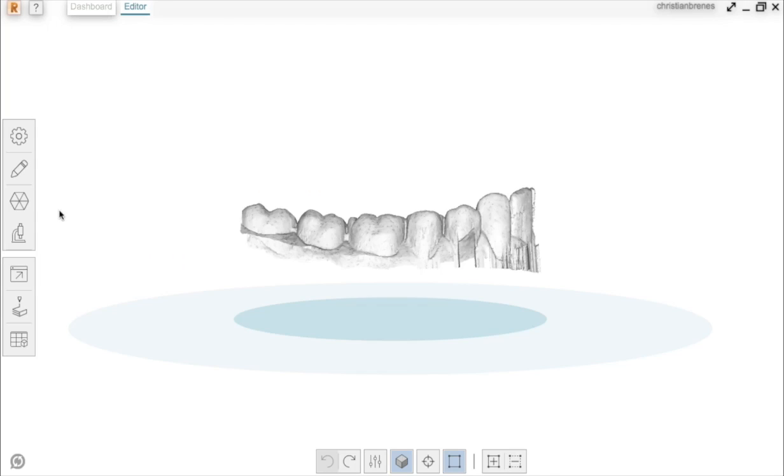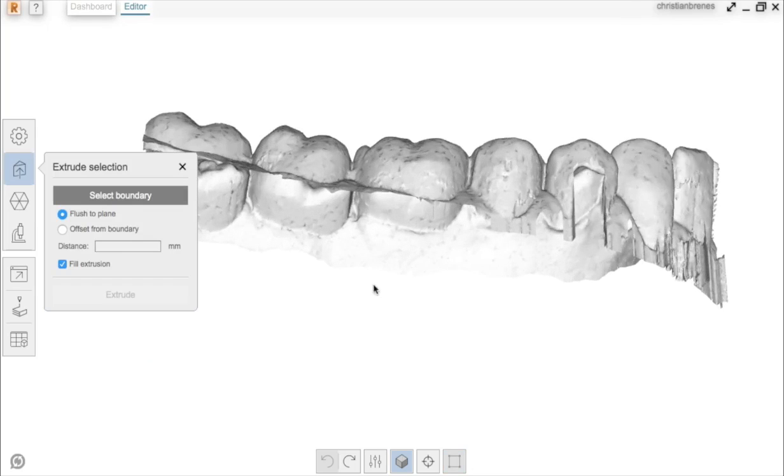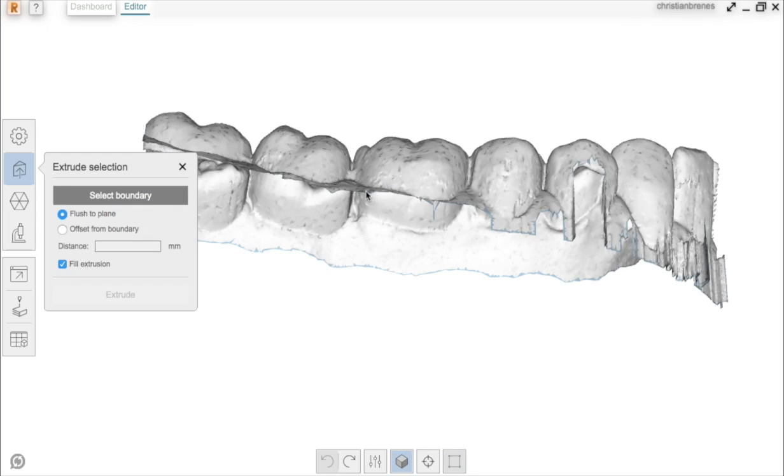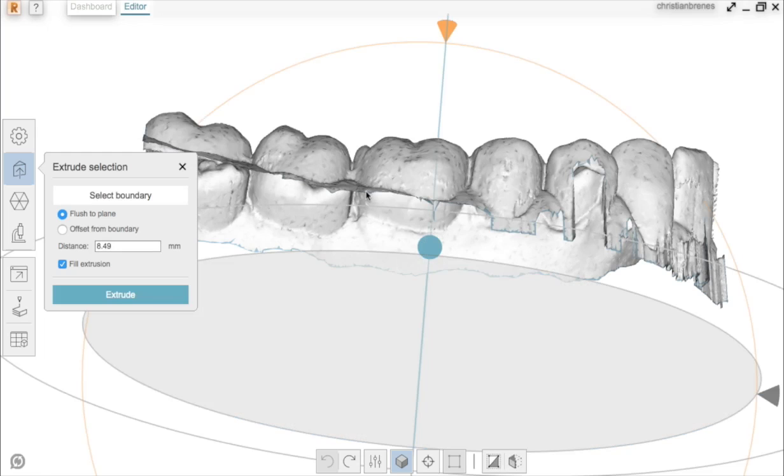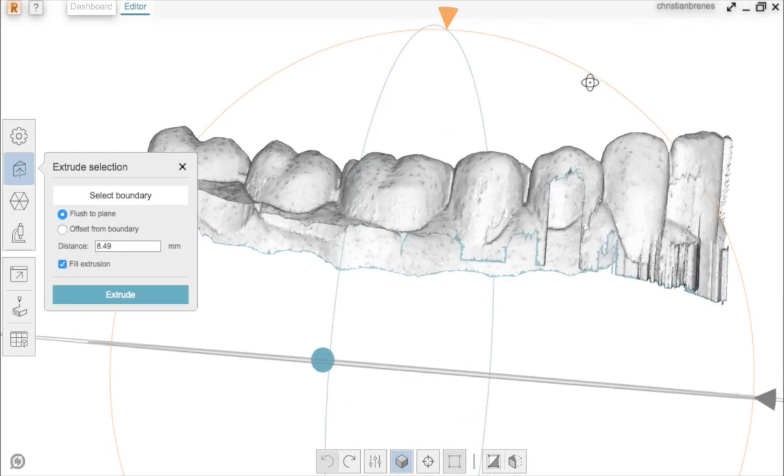For creating the base, you go to the pencil icon and select Extrusion. The software is going to ask you to select the boundary of the model, which is highlighted after you position the mouse on top. Click on the boundary.